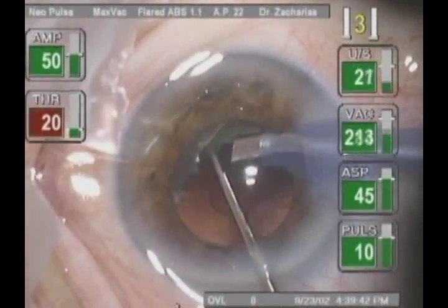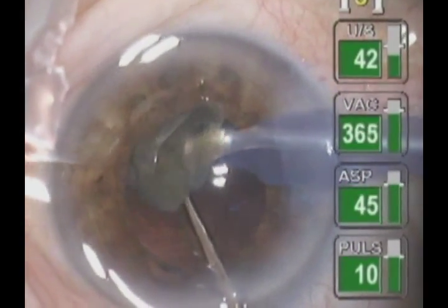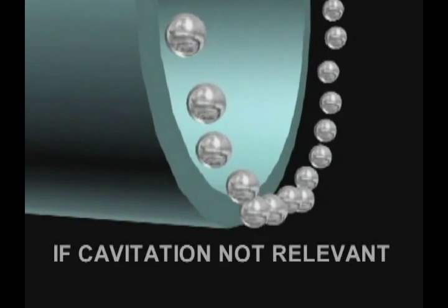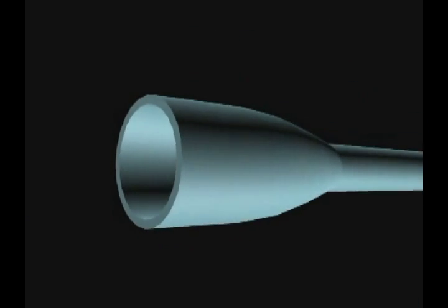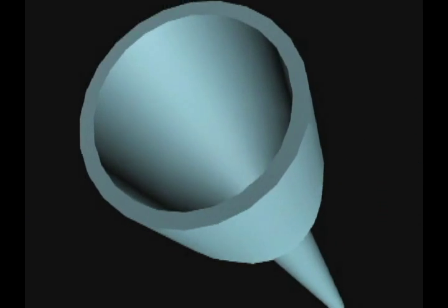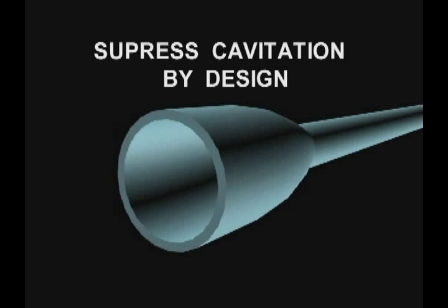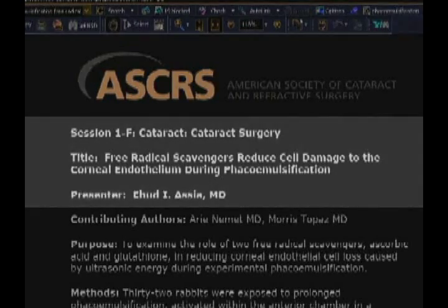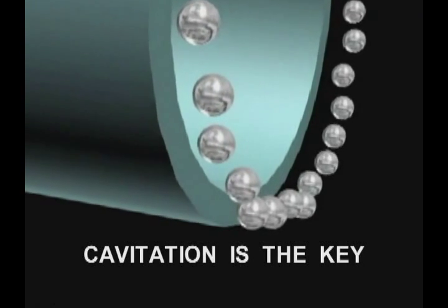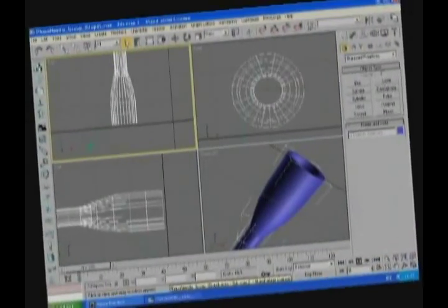There are practical implications in the determination of the true mechanism involved in phaco emulsification. If cavitational energy is found irrelevant for phaco action, it would make sense to design phaco tips that exhibit reduced cavitation to avoid harmful effects such as free radical formation. If on the other hand cavitation is the main basis, then other design approaches would be required.